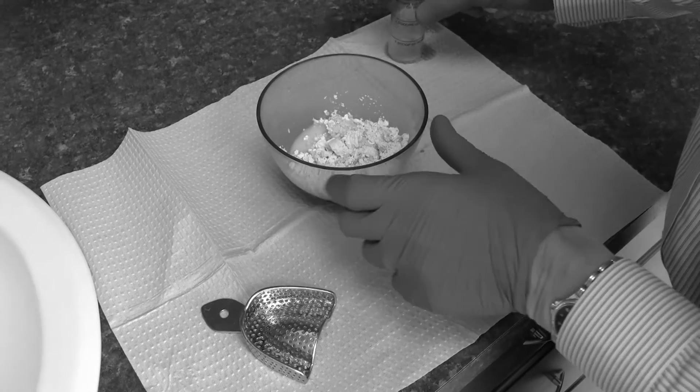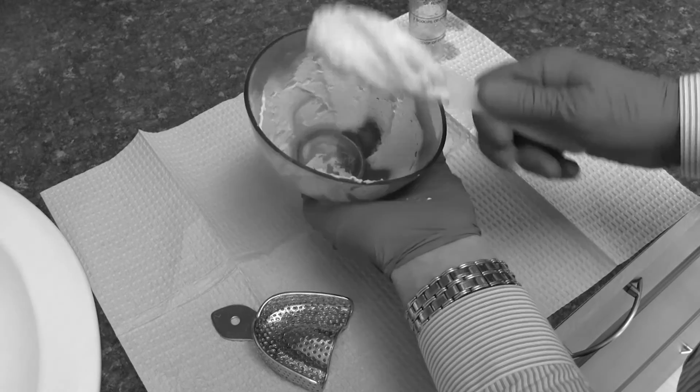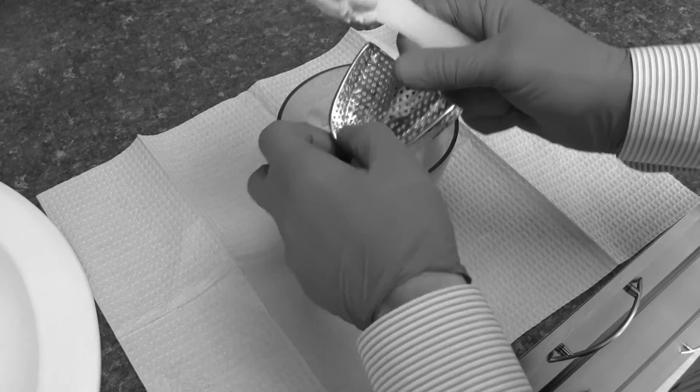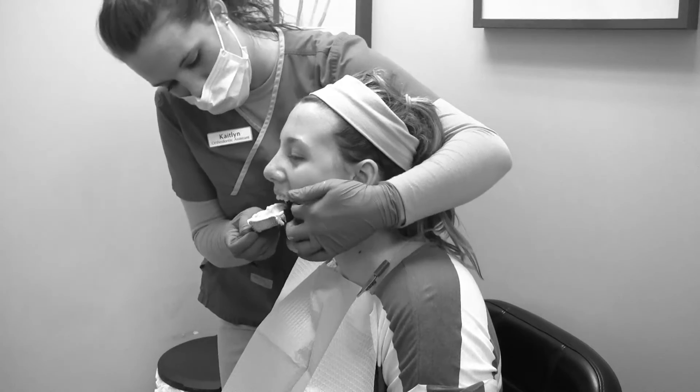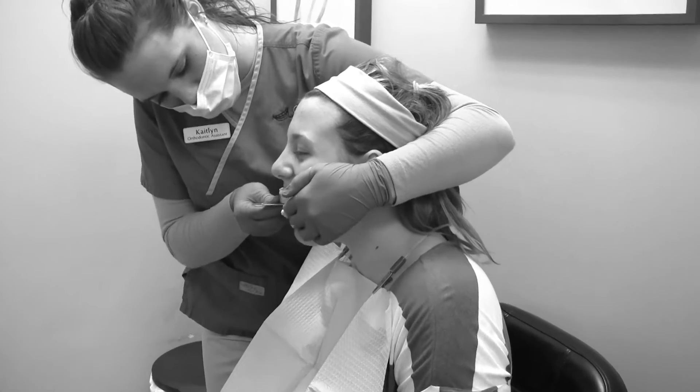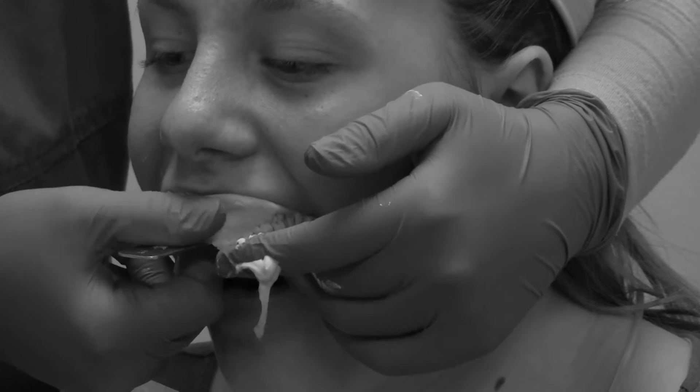Back in the good old days, orthodontic offices used to use a mixture of powder and water to get impressions of people's teeth. The mix starts out like a thick icing and sets into a rubbery mass, then smooshed over the teeth. As a gagger myself, I can honestly say that impressions are the worst part of orthodontic surgery. Most orthodontic offices still use alginate, but there's a better way.